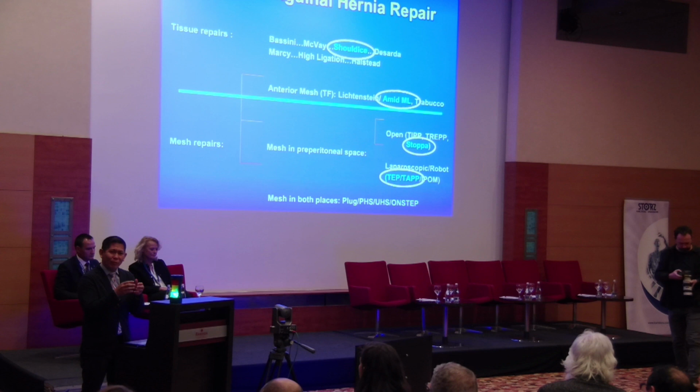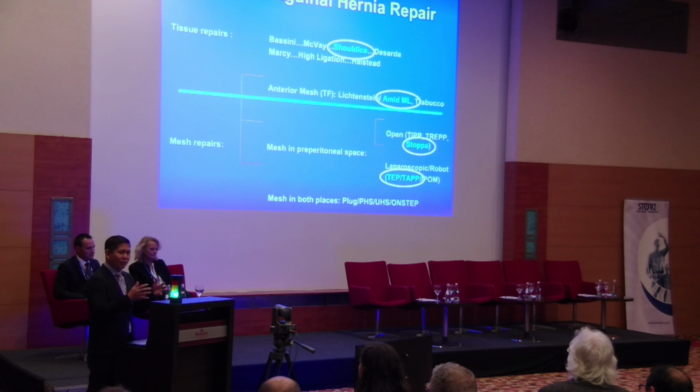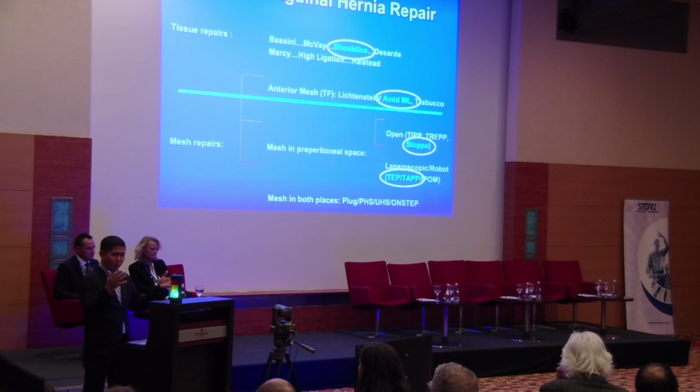The problem is everybody does a Lichtenstein a little bit differently, and when you deviate from that, then it doesn't have the same outcomes as when you say, oh, I did a Lichtenstein. But did you do all the same steps that would make the outcomes ideal?